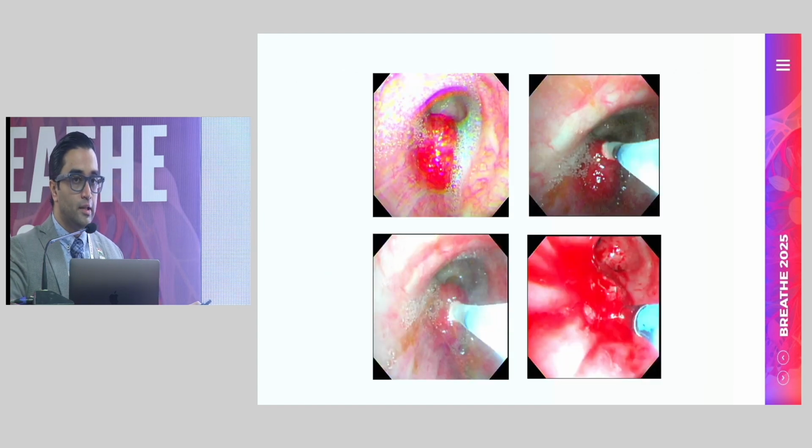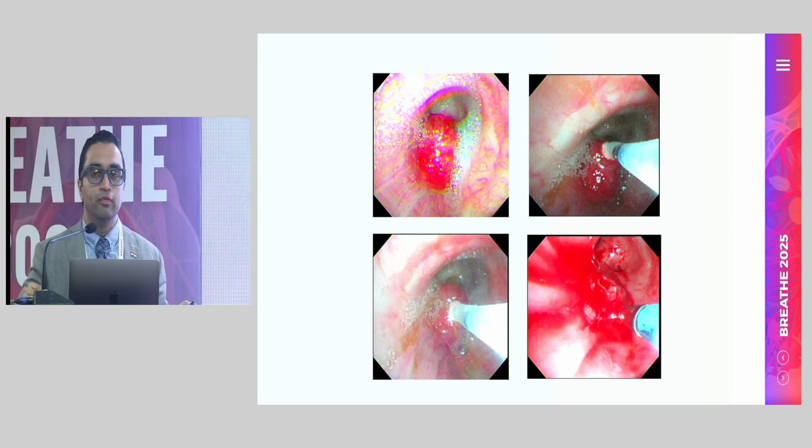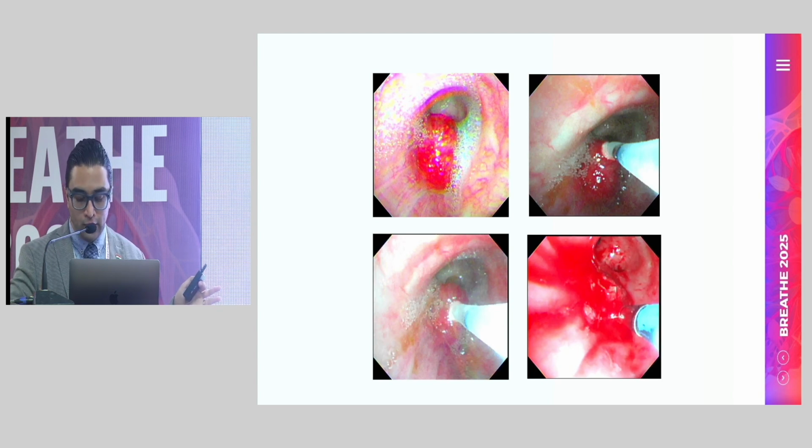There's something called cryoablation. So at times when you have a slow growing tumor, you can just touch the cryoprobe, freeze the tumor, and then let it thaw. You can freeze-thaw, and call the patient after 2 weeks to just see that the tumor size has reduced. But this can be done only in non-critical cases.